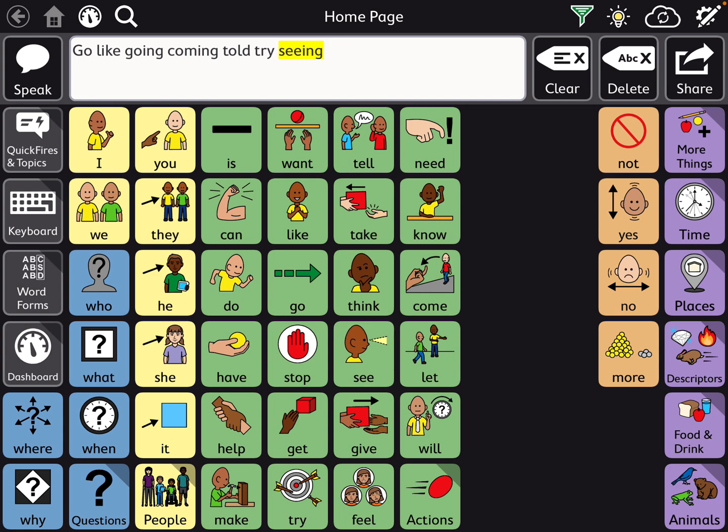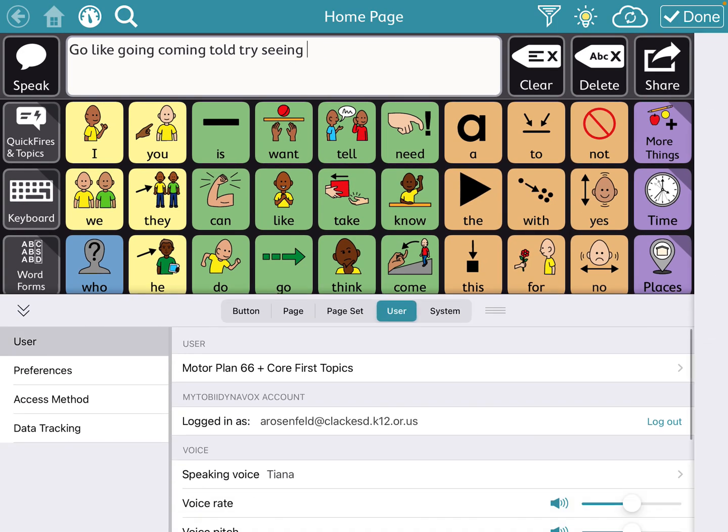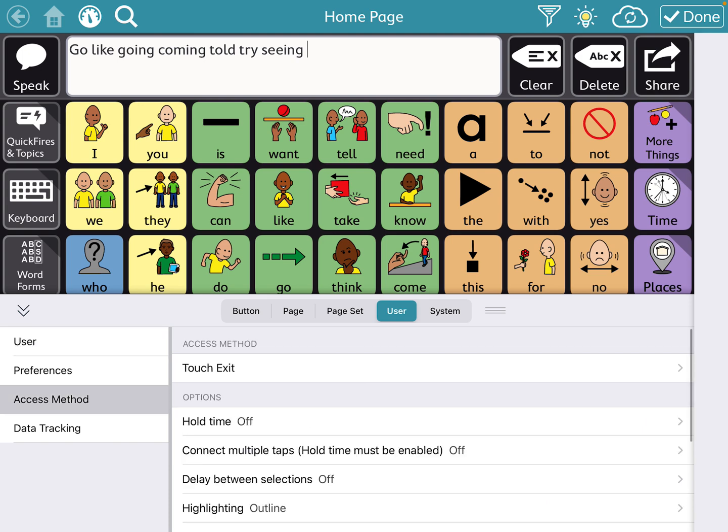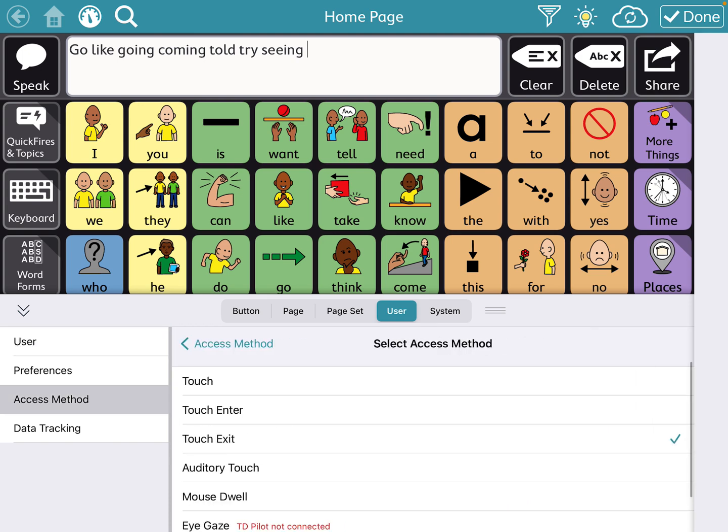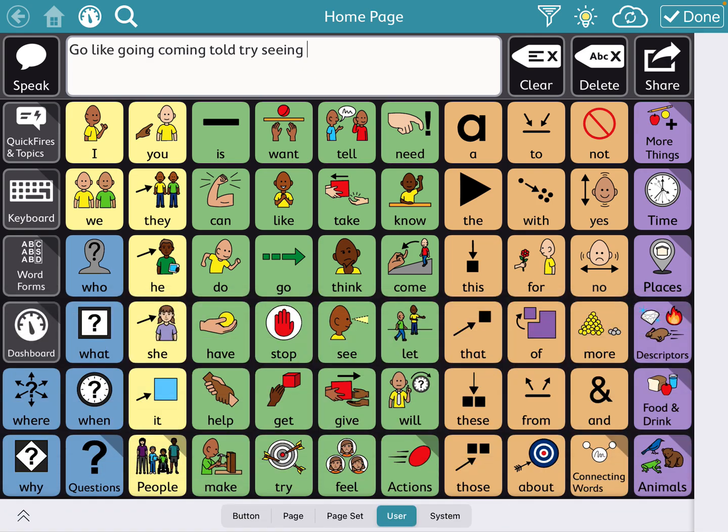So it's still kind of had a delay. And so if you go into here and then you change the access method to not touch exit. So touch exit was still on, which is my mistake, just going to touch instead. And this is what the natural or automatic settings would be.